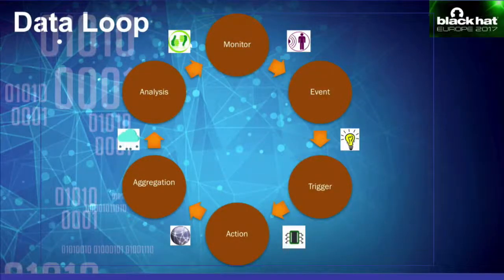When I was doing this research, this is what an information loop of a typical medical IoT device looks like, and I'll explain it with the example of a simple insulin pump. At rest, the device is always in a monitoring mode, so it monitors, for example, your insulin level, your blood pressure, etc., using sensors.